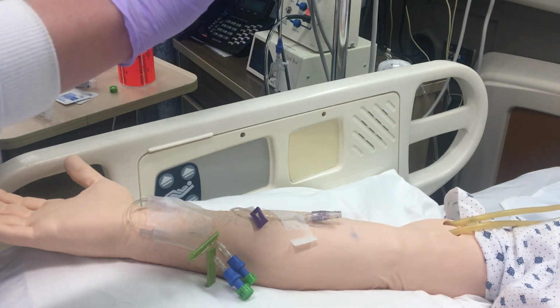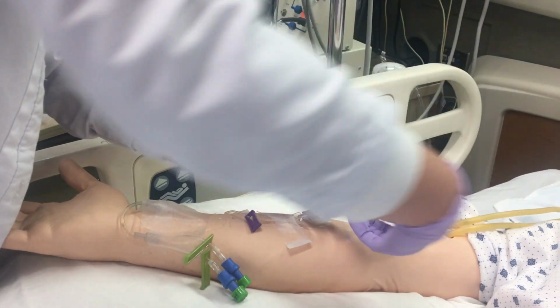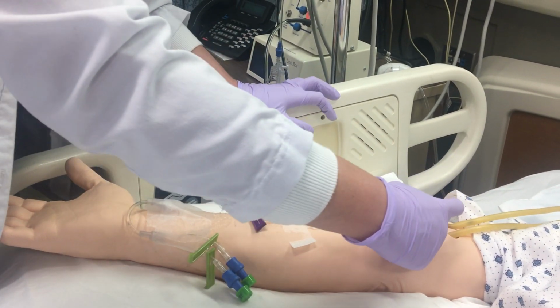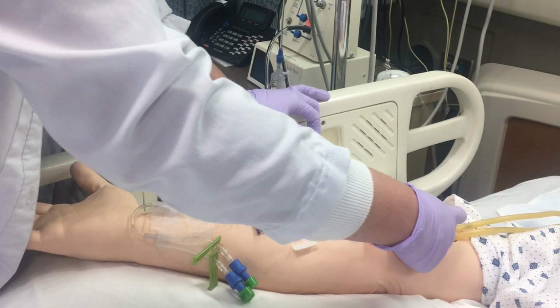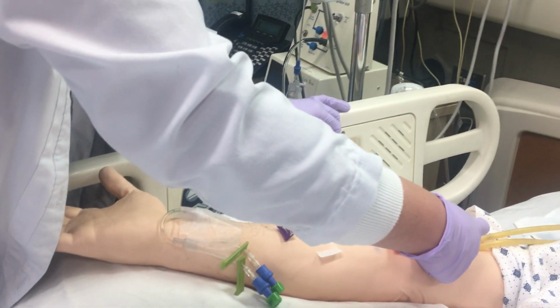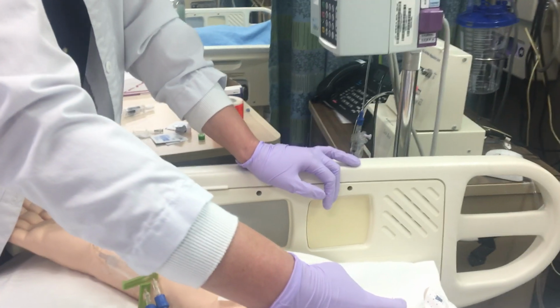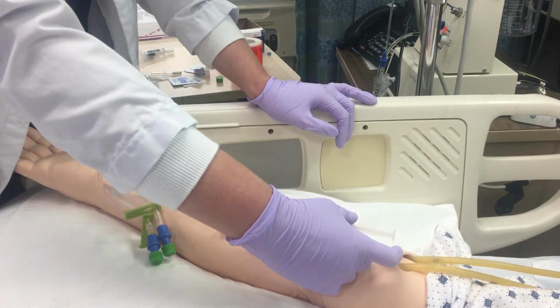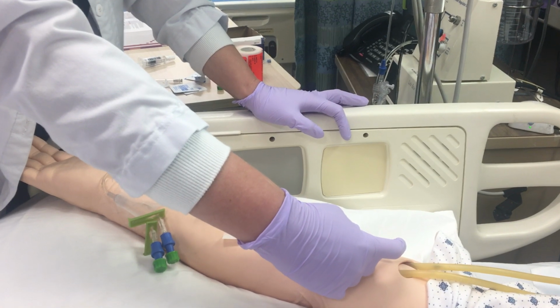Here is my medication, and as defined earlier, we would give this medication over 1 minute. For the purpose of this video, I'm going to push it a little bit faster. As we push the medication, you may find some nurses pulse to administer the medication, or you might find that some nurses give a small amount, stop, time it, and then administer another small amount.